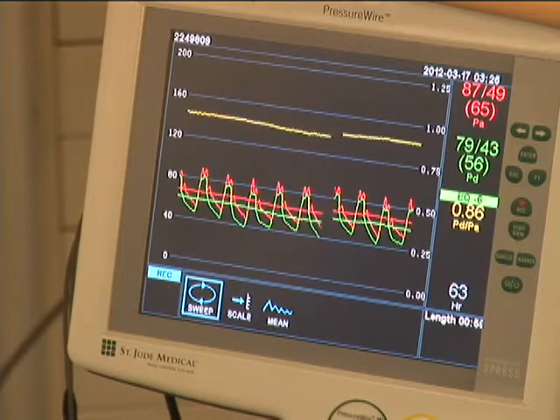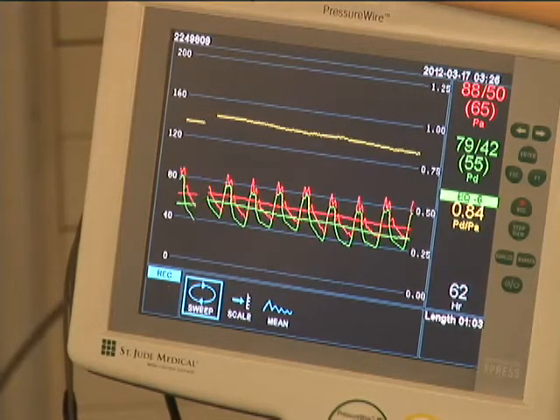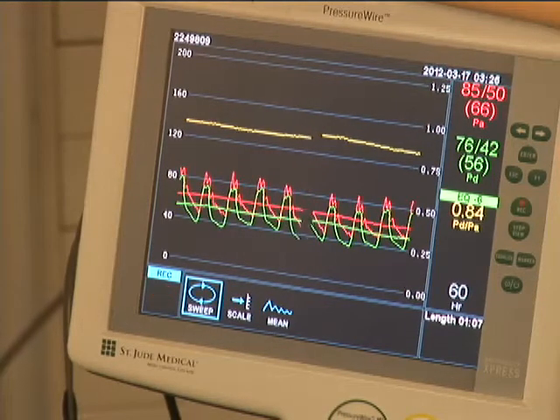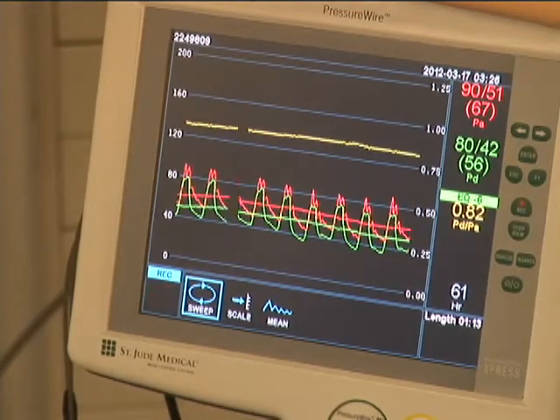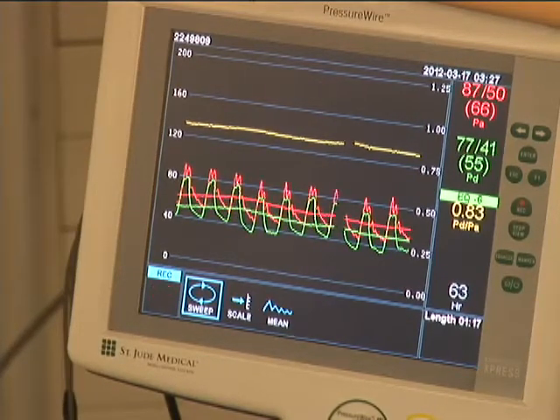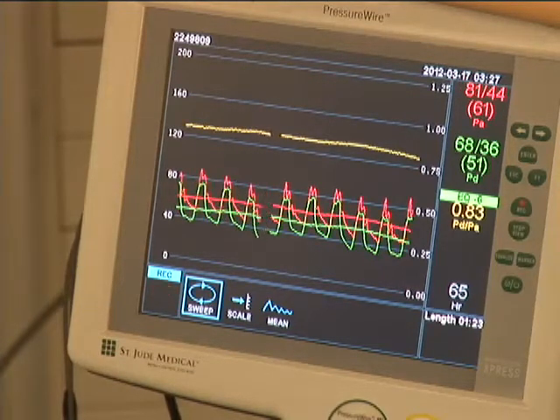An infusion of IV adenosine is then administered per protocol for 2 minutes to induce maximal hyperemia in the coronary artery. During adenosine infusion, the patient may experience nausea, flushing, and/or chest discomfort. These symptoms are secondary to adenosine infusion and quickly resolve upon termination of the infused drug.